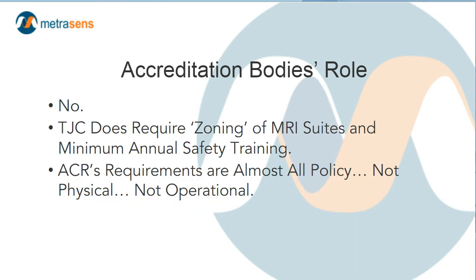So do we depend on accrediting organizations to assure safety in the physical environment and the execution of clinical care in that physical environment? No. Joint Commission does have some minimum zoning requirements and some minimum annual safety training requirements.